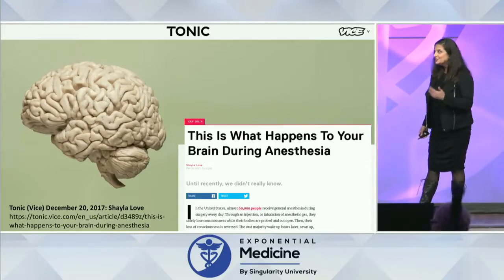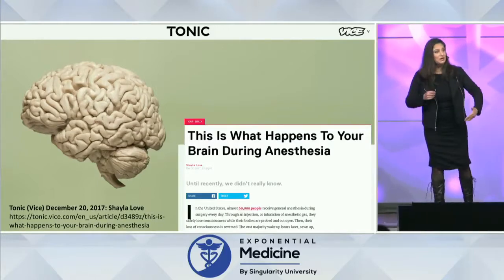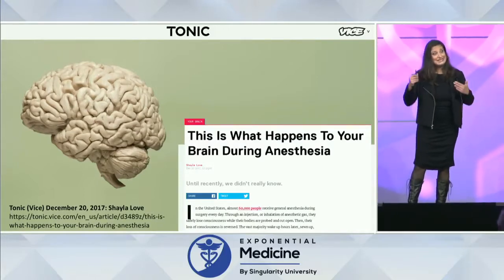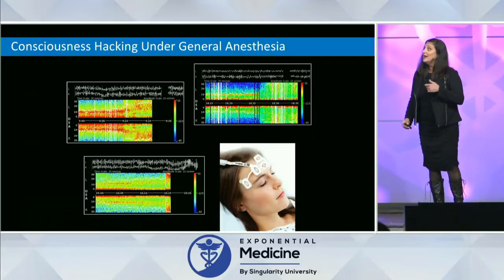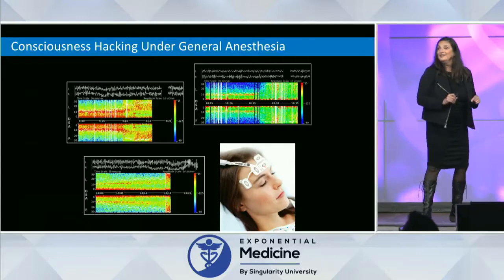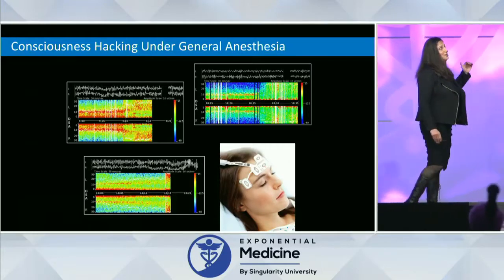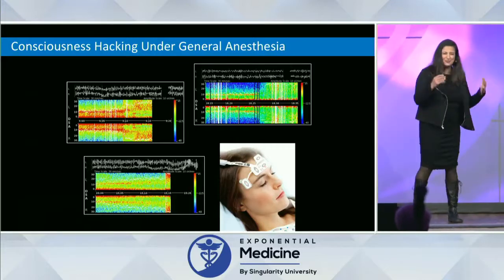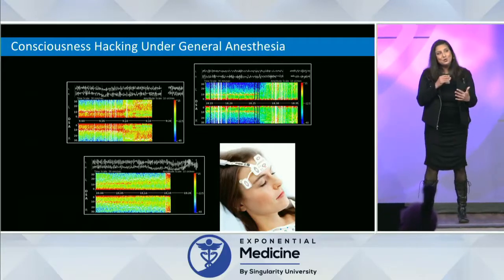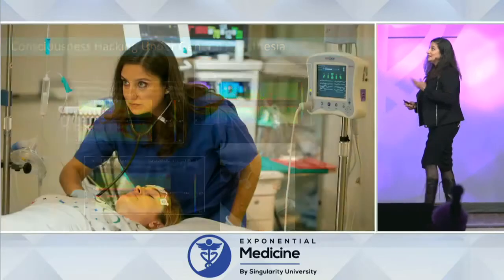So what I actually do is I go into the operating room and I record brainwaves from all of my patients as I take them through an anesthetic. And in fact, that's what it would look like. You can see a model patient with an electrode array on her forehead. And we're able to sort of hack this process of understanding what neural networks look like as we transition from the conscious and aware state into unconsciousness.